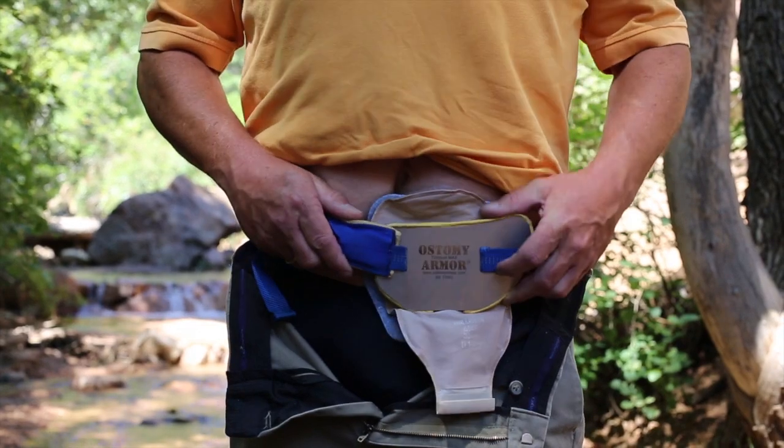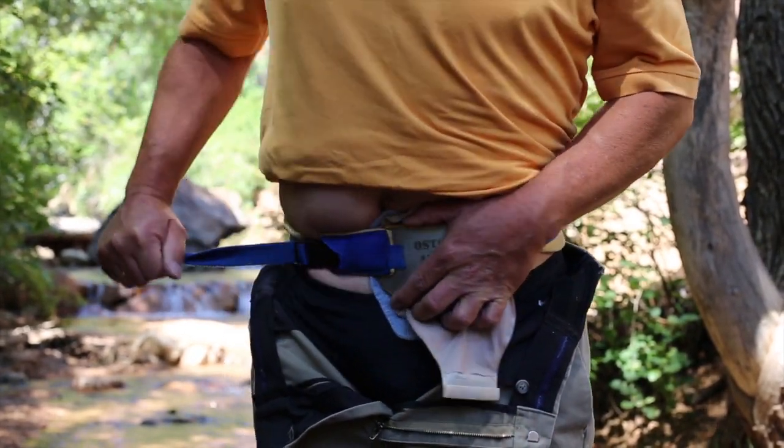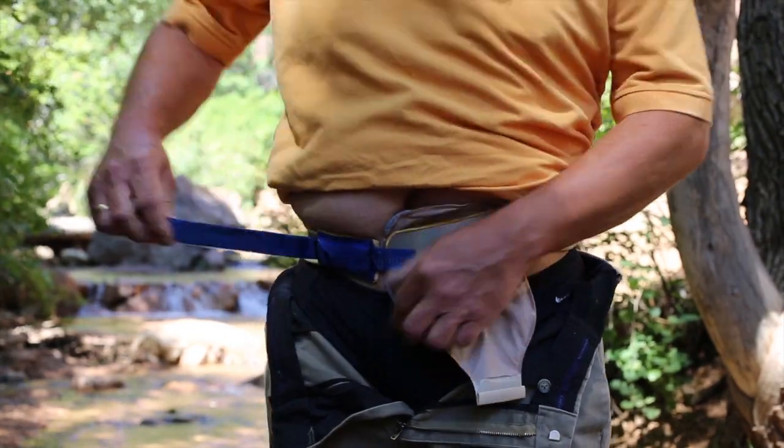Then slide the armour back down your waist and tension it in place. Adjust your clothing and you're ready to go.